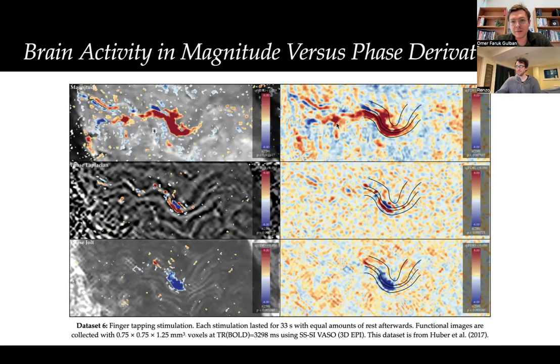And here, especially for Paul Taylor, I plotted the unthresholded maps as well, putting the gray matter boundaries. And you can see that there is no doubt that there is activity that correlates with the task, and you can detect it very easily with magnitude gradient echo BOLD imaging. Now, let's compute the phase Laplacian and do the same. Well, this is FDR thresholding, by the way. So you can zoom in and look at the values, but they are in a similar T statistics range.